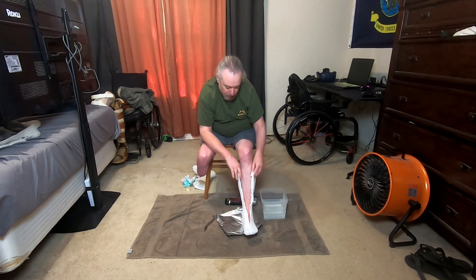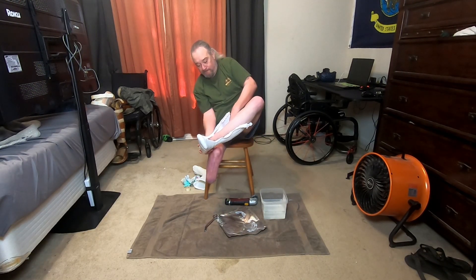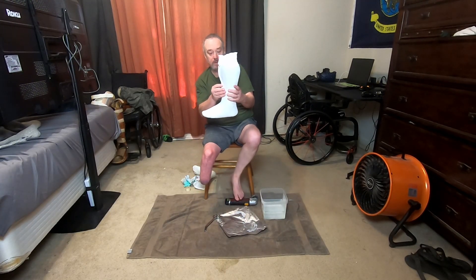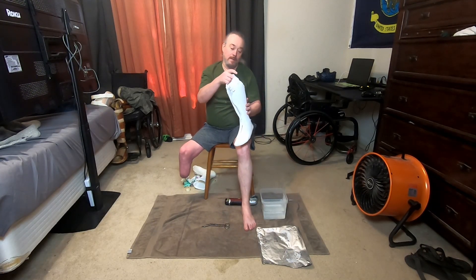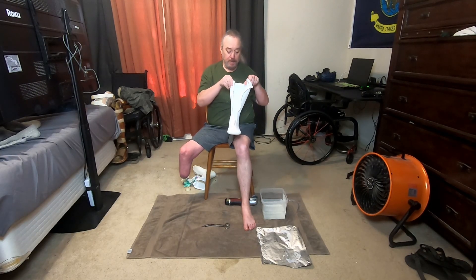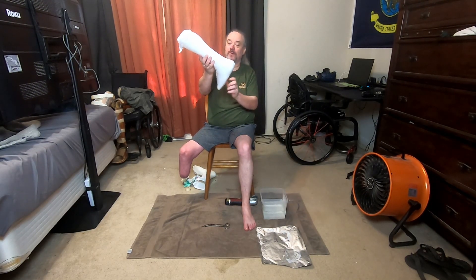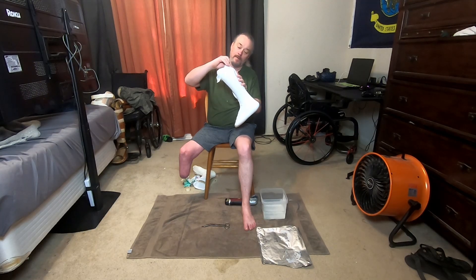Now we can pull the foot out. It's still not quite completely dried yet, but it's got enough of a mold. Look at that — that's going to make a great AFO mold right there, let me tell you. It's like a perfect 90-degree angle, and this is going to continue to harden. But it's going to be perfect.